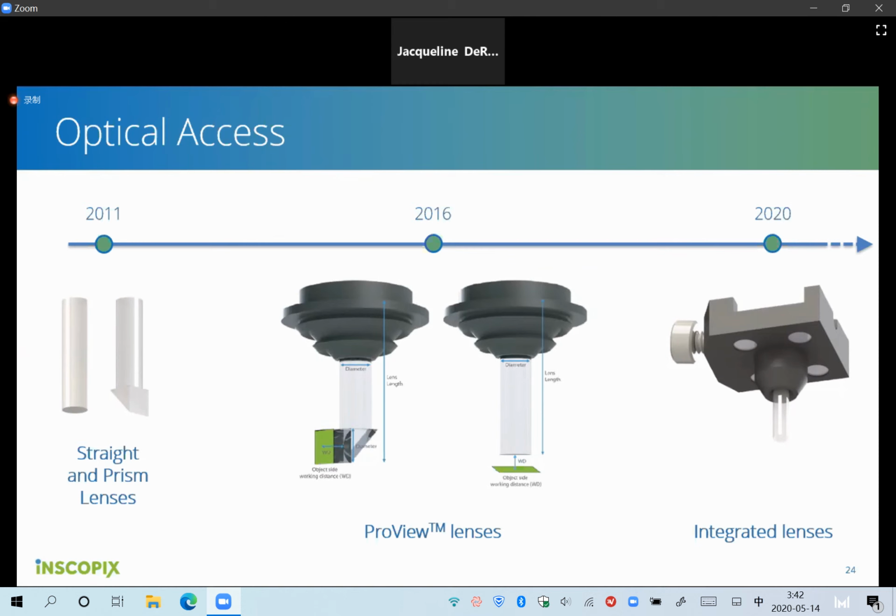And perhaps a reminder that with our systems, the ability to image through the tissue is one of the benefits, I believe, with the electronic focus, correct?